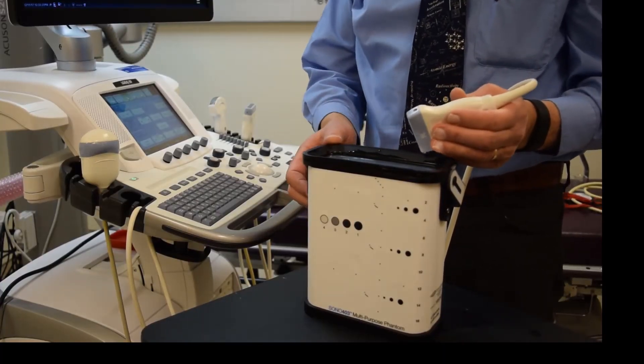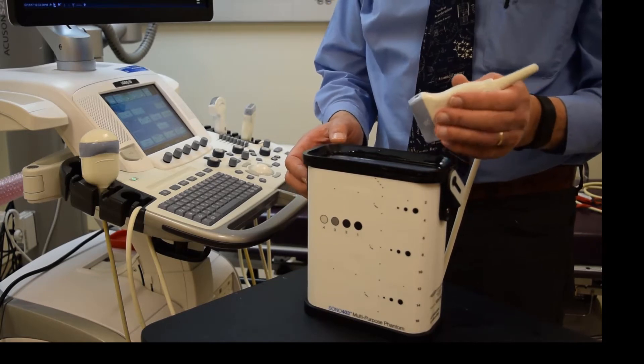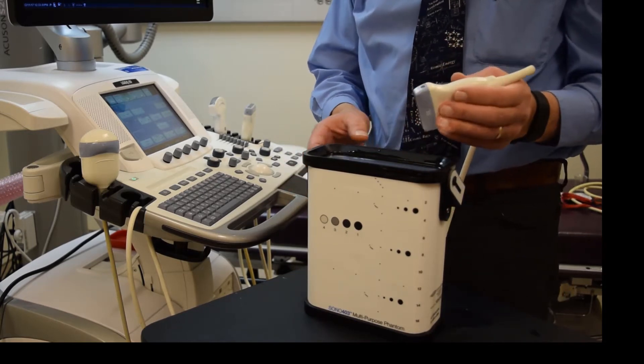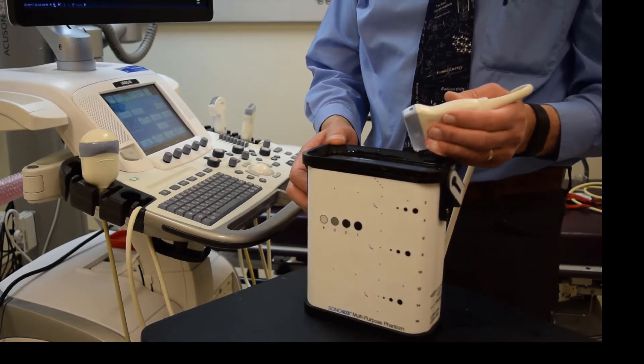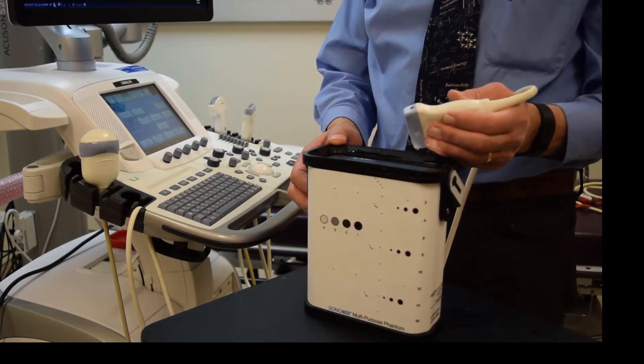Sun Nuclear's Sono 403 Phantom is shown here. It's a general purpose phantom ideal for ACR tests. It's tissue mimicking, meaning it has a sound speed of 1540 meters per second.